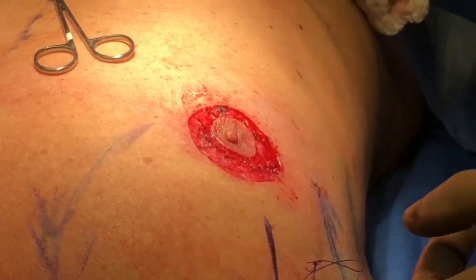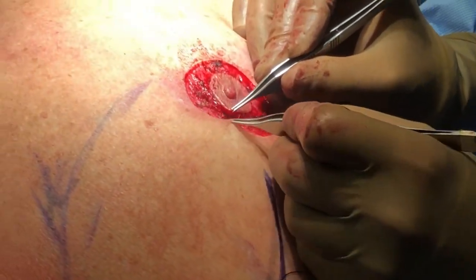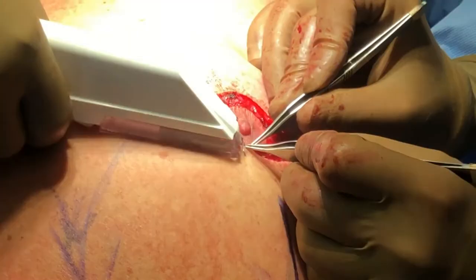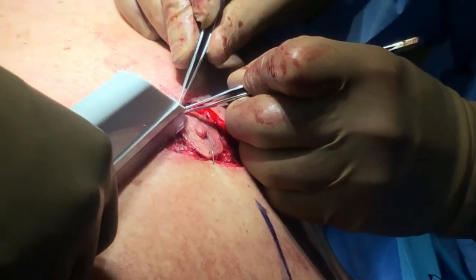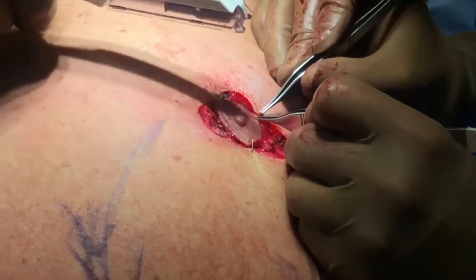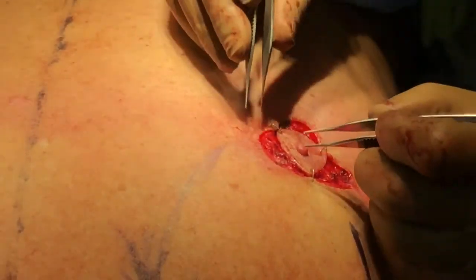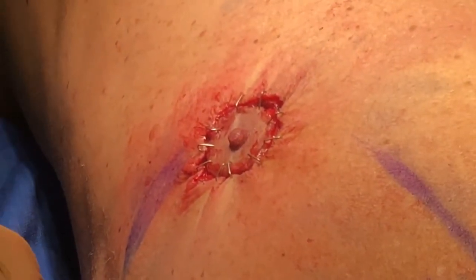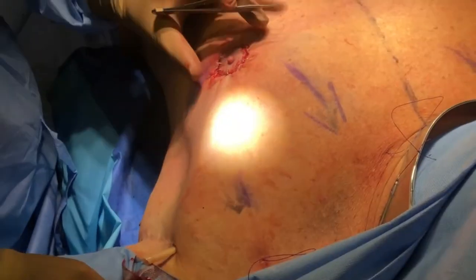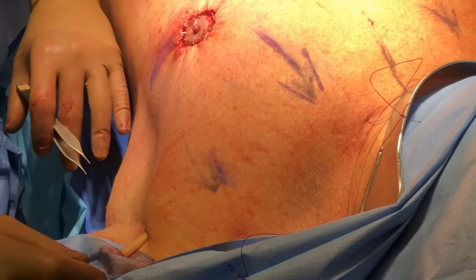Diana's going to staple for me. I'm going to staple this baby up. What you can do is you can do it in thirds — two triangles. But what we need to do is we need to cheat down a little bit, because we need to move all this upper stuff down below and cheat it. So here we are — we've put on our drain up in the corner going down here, it's for egress. We've tailor-tacked it up. It looks beautiful. Now it's giving us our lift. We've done the liposuction down in this area.